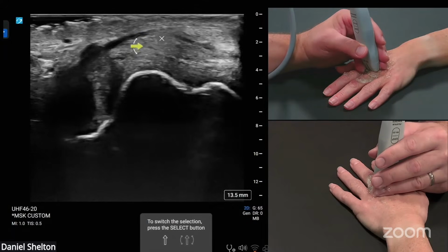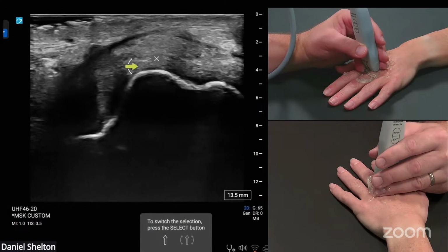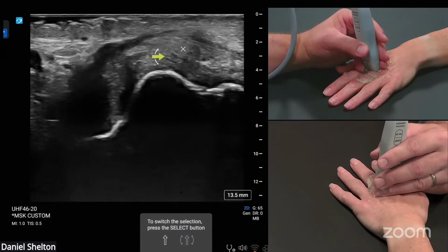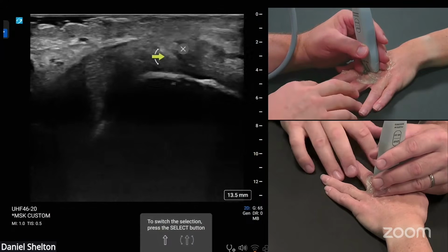Sagittal band, superficial and deep. And then we can see collateral ligament anatomy starts here. Somewhere in between here is the joint capsule. It's really thin, it's normal, and it's just a potential space at this point. But to delineate potential space, just like in a subacromial bursa in the shoulder, I'm going to spread her fingers a little bit.